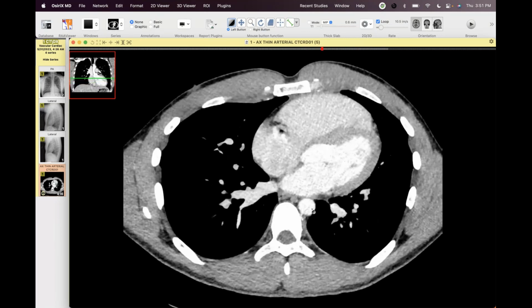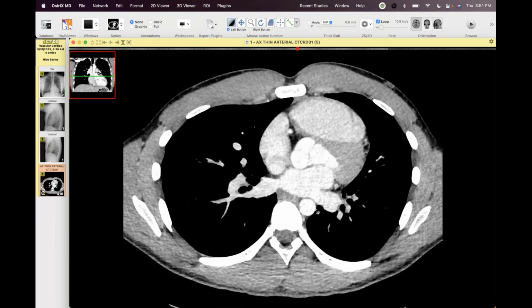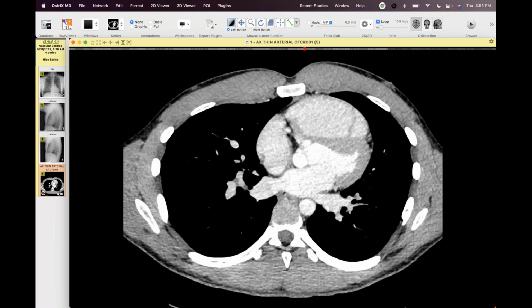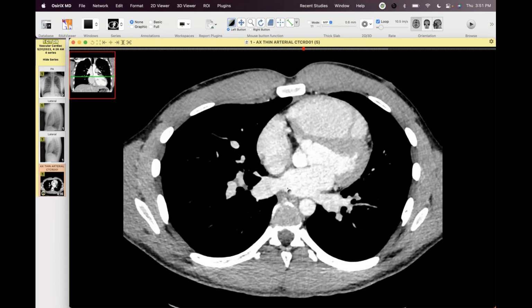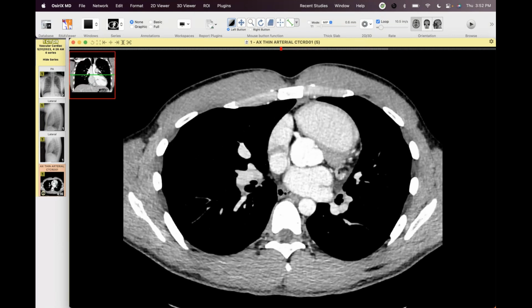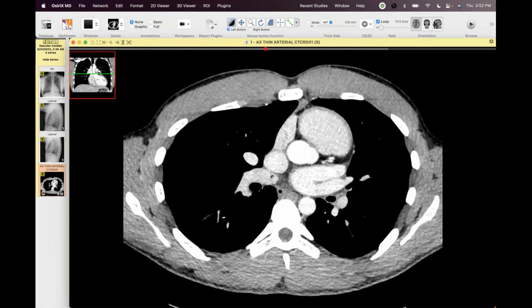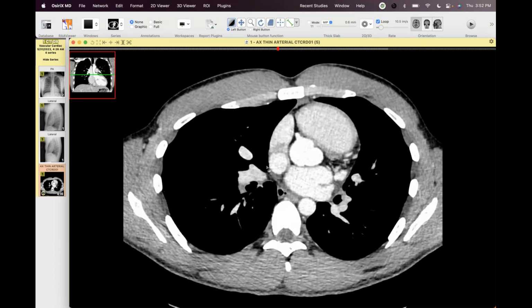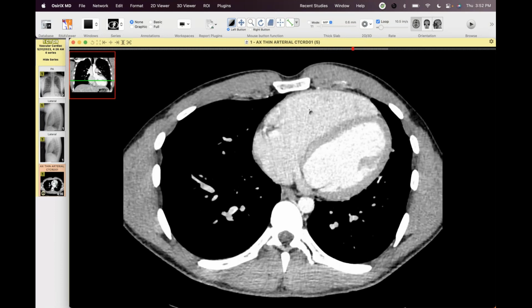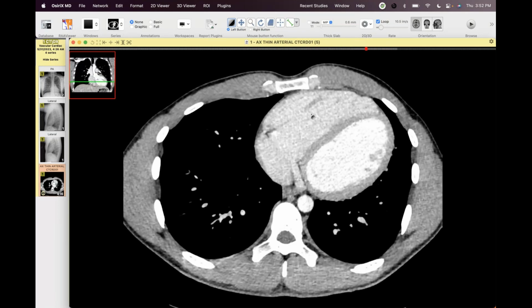It's interesting because this was unexpected, and this was one of those ones that, to credit my colleague, she was very persistent in trying to get in touch with the electrophysiologist because of the finding that she saw. On the right side, you can see there's one right inferior pulmonary vein, and then the right superior pulmonary vein is obviously draining anomalously into the superior vena cava. There's no associated sinus venosus ASD, but you can see the RV looks like there's probably some increased circulation and some significant shunt fraction.